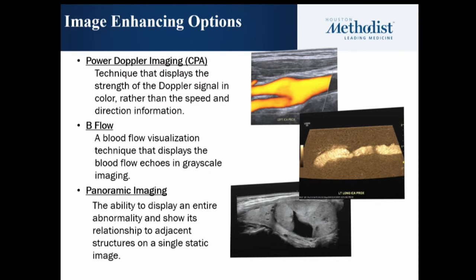Panoramic imaging, of course: any structures that are wider than the transducer itself will require it. It's actually quite difficult to use panoramic imaging. If you've ever used it before, you could tell that it does take quite an amount of skill to move from point A to point B. But definitely it can show larger structures and give you a general estimate of how large it is.